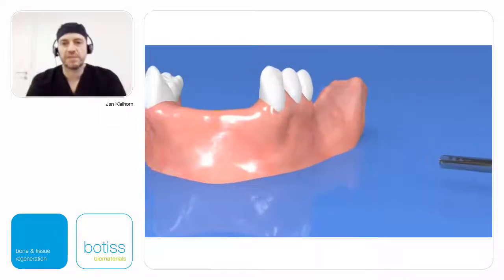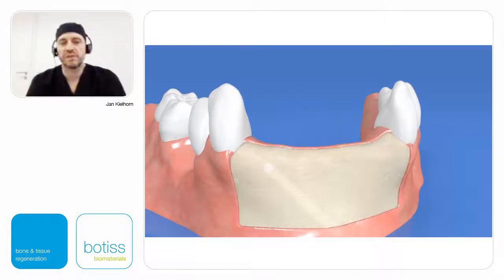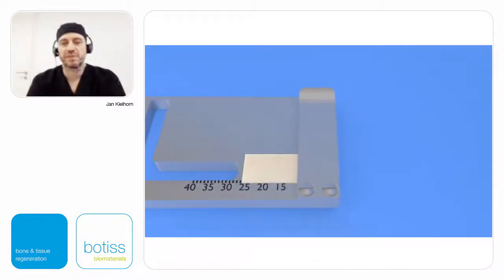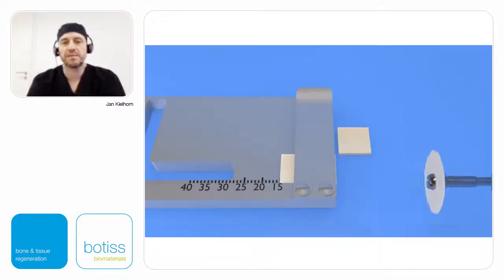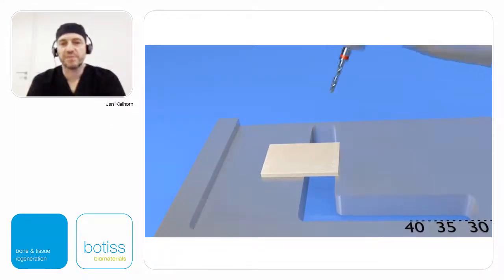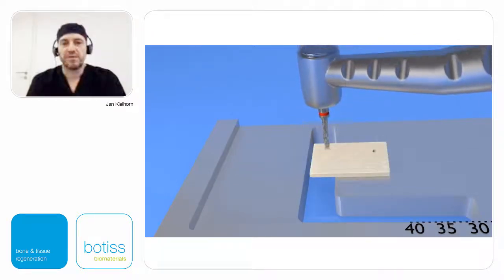how the cortical strut is used. We got a cortical strut cutter, so you could cut that cortical strut, not harming your hand or taking a round saw in order to be careful with it. It's very nice to cut like a piece of paper. You just measure the dimension you need of the cortical strut. For example, here in this case would be 15 millimeter. Then you just place that, so you got a measurement on that cortical cutter, and then just cut it very easily without having the danger of cutting your finger or flying the bone through the surgical room.